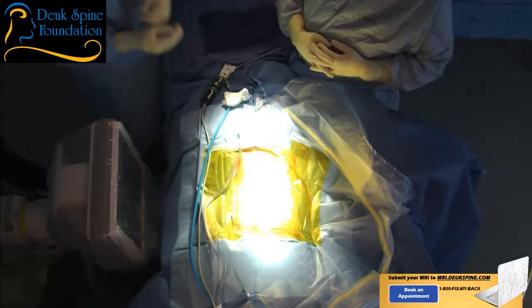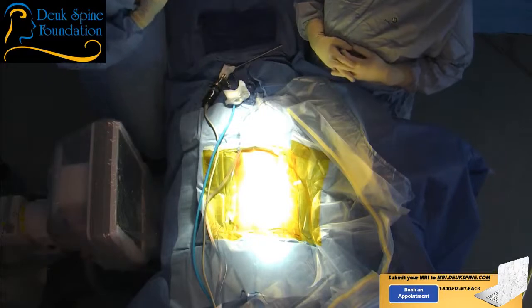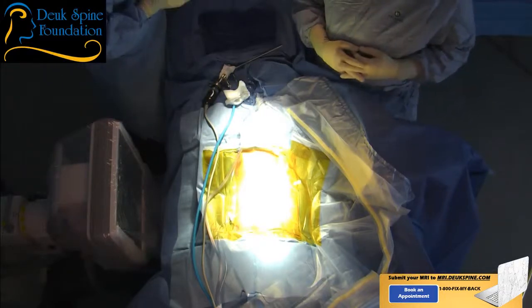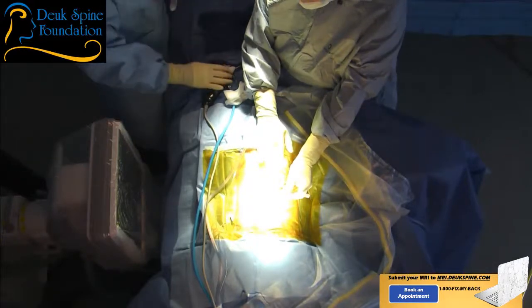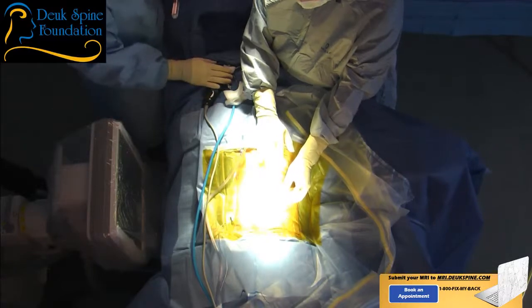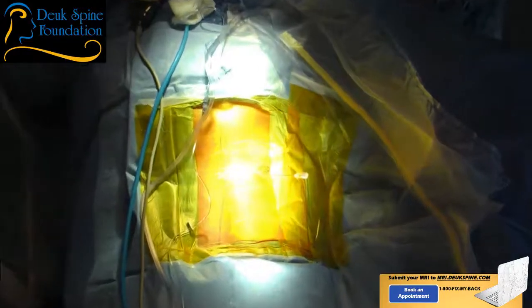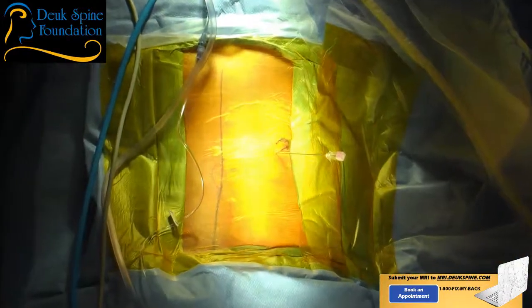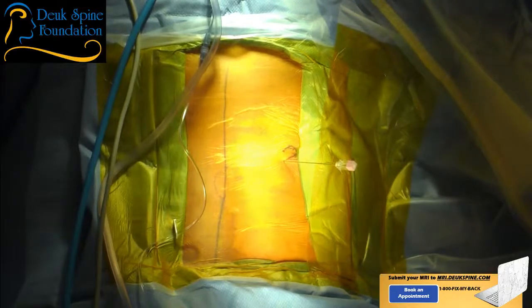The X-ray machine will help guide us to the right place in the spine — the L4-5 disc. We're going to navigate right there. I have to assess my entry point and my trajectory and make sure they're both proper. I need to make sure the X-ray machine is lined up with the spine perfectly. We'll wag the fluoroscope arm slightly to line up the inferior end plate of L4 better.